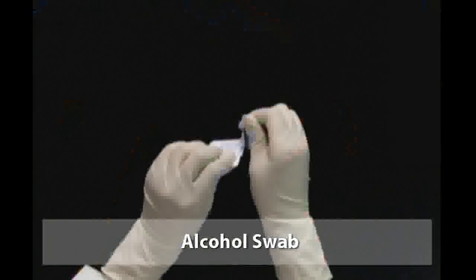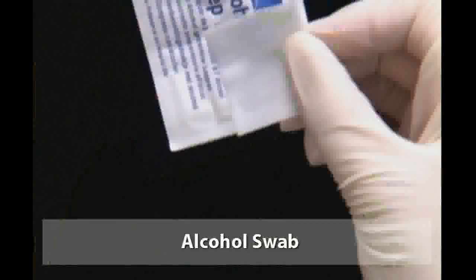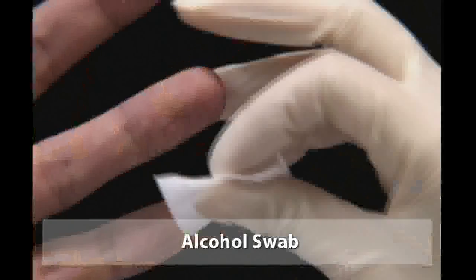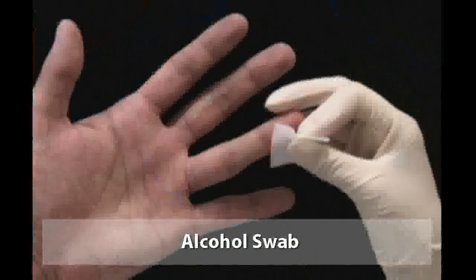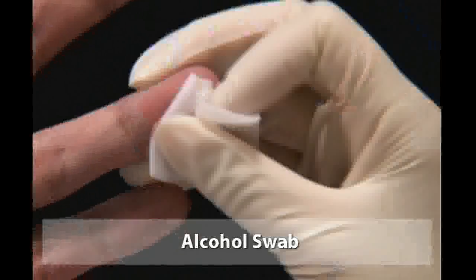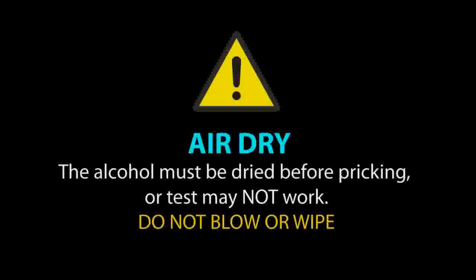Open the alcohol swab. Grasp the fourth finger of the patient's hand. Clean the patient's finger with alcohol swab thoroughly. After cleaning the finger, it must be allowed to air dry. Remember, the alcohol must be dried before pricking, or test may not work. Do not blow or wipe the finger when you dry.